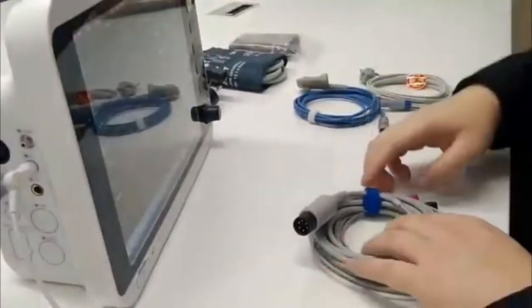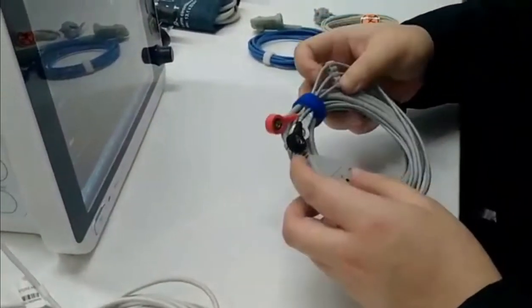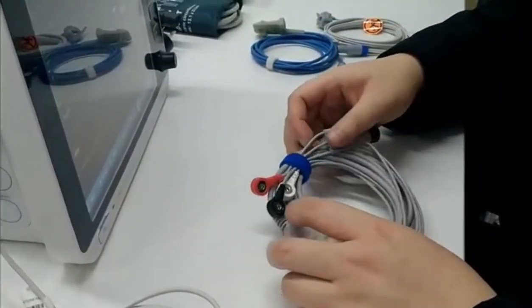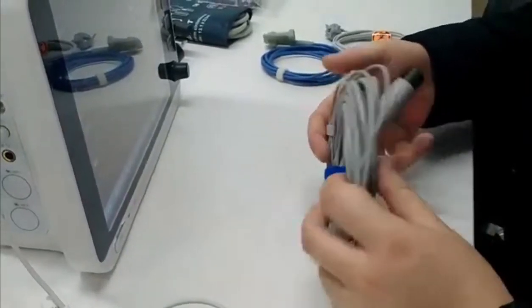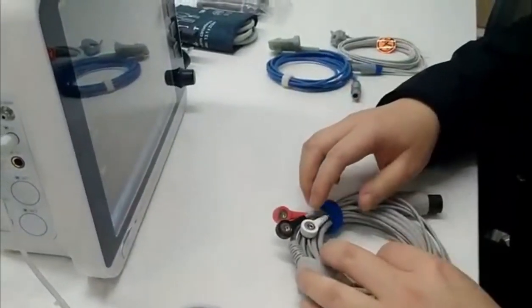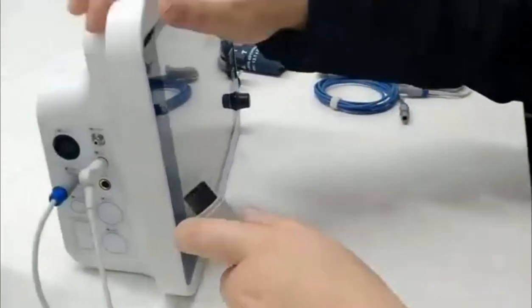This is an ECG cable, normally for adult patients — it is 5-lead. This one is 3-lead, normally for children. The connector is the same.